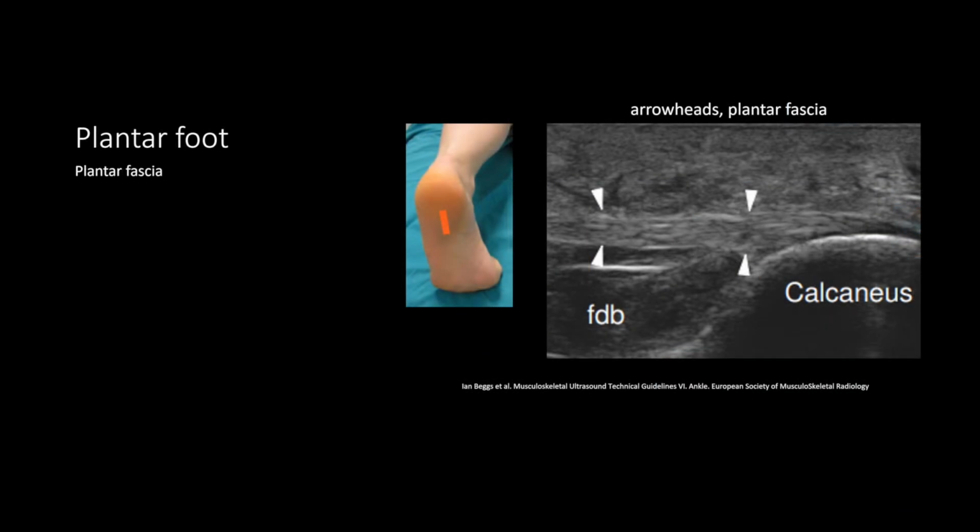For the plantar foot, you want to place the patient prone and then place the probe at the plantar aspect of the hindfoot. Measure the plantar fascia where it leaves the calcaneal tuberosity.